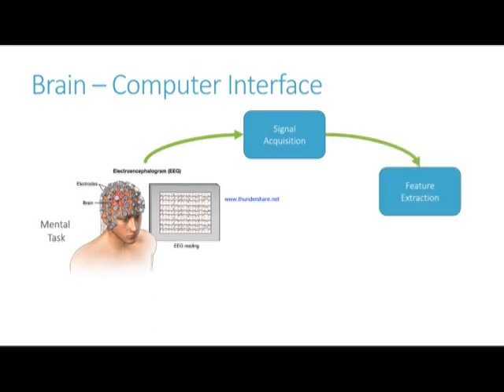The first step is called feature extraction, describing the EEG signals by a few relevant values called features. Such features should capture the information embedded in the EEG signals that is relevant to describe the mental states to identify, while rejecting the noise and other non-relevant information.